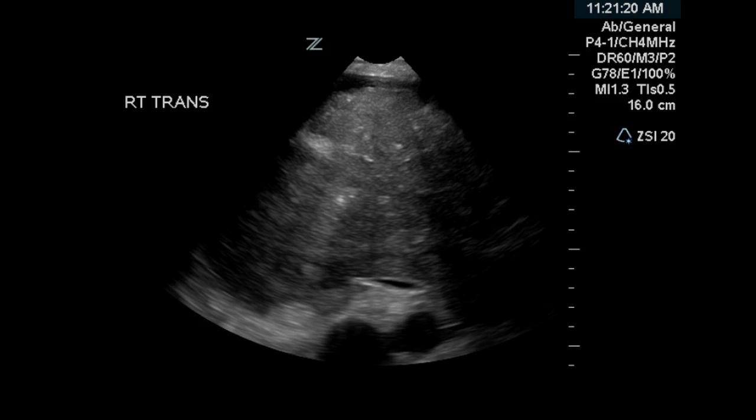This is an ultrasound examination with Doppler interrogation of the liver. This is a transverse image of the right lobe of the liver, and this liver appears to be heterogeneous in appearance with focal hyperechoic areas. There appears to be a small amount of free fluid anterior to the liver.